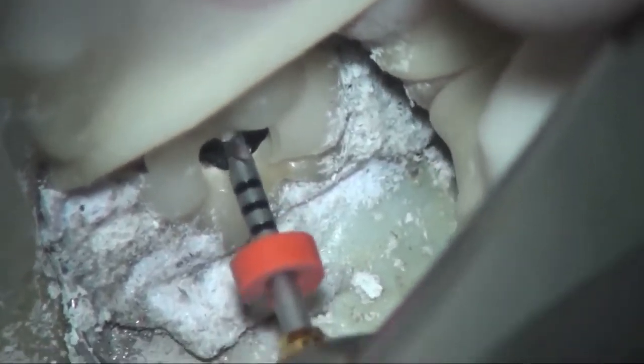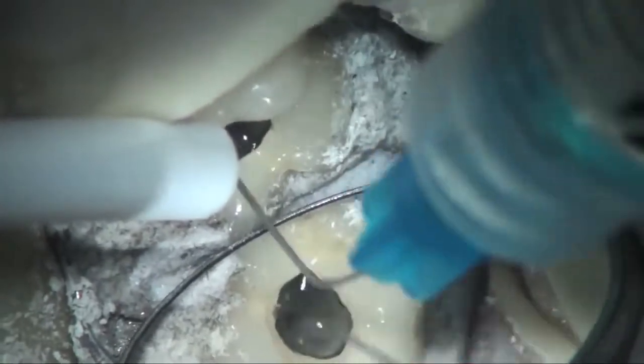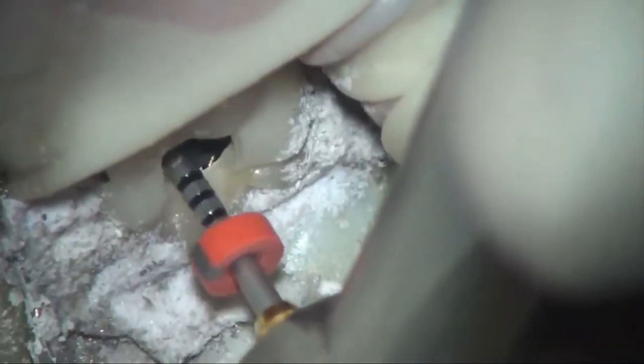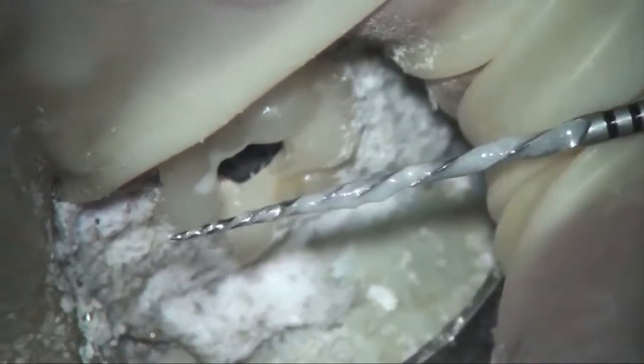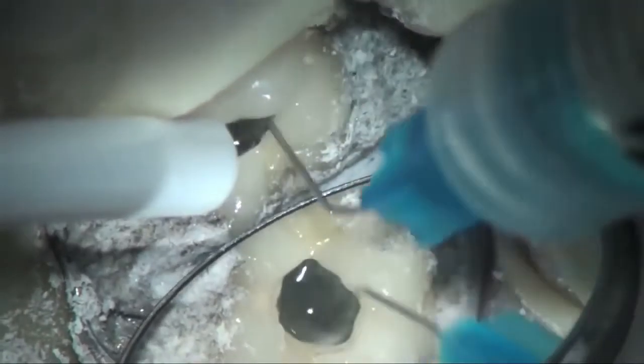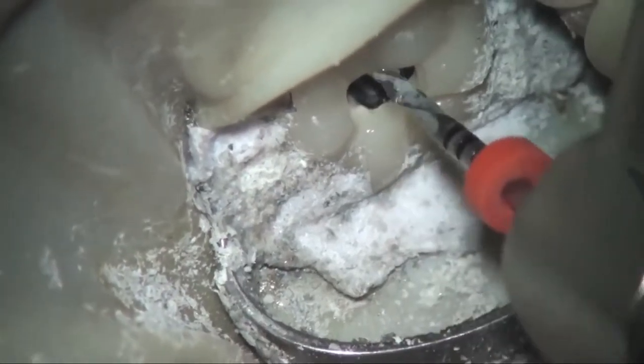The tip of the Wave 1 instrument is placed at the orifice of the canal. While in reciprocation, the Wave 1 file is introduced into the canal using very small in-and-out movements of no more than 2 to 3 millimeters, without pulling the instrument completely out. Very light pressure should be applied; the instrument will advance easily in an apical direction. After about 3 in-and-out movements, or when resistance is encountered, or when more pressure is needed, the Wave 1 instrument is pulled out and cleaned. Irrigation is introduced and a hand file checks patency. These steps are repeated until the instrument reaches working length, after which the canal is ready for final disinfection and obturation.